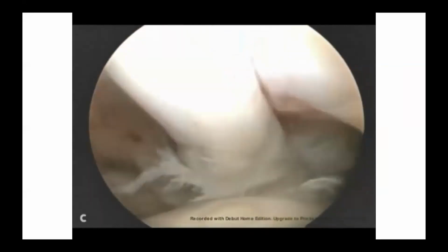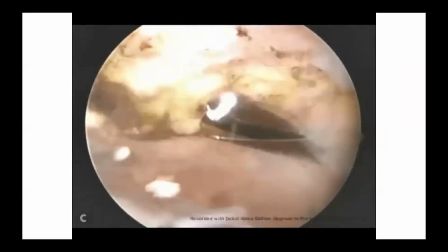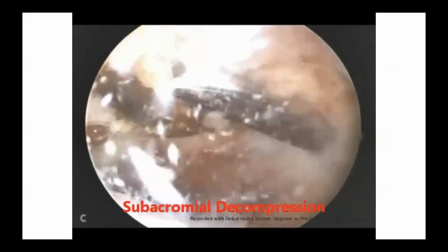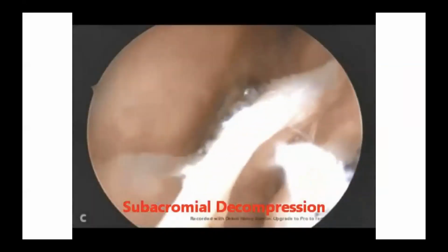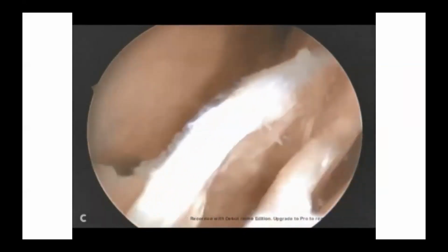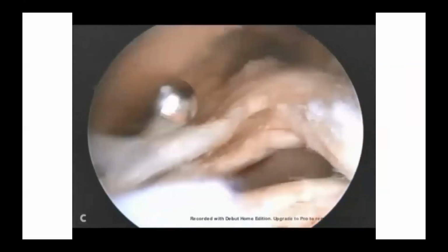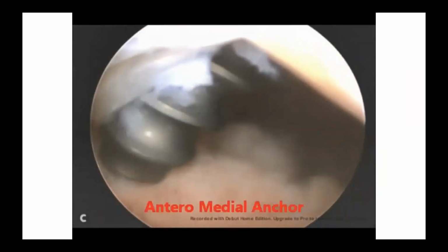And usually in this case, I make a biceps tenodesis with the cuff. I prepare the footprint, then go to the subacromial space, doing subacromial decompression. Then shifting the scope to the lateral portal and working with the instruments from the posterior. You can see here how massive and delaminated the tear is.